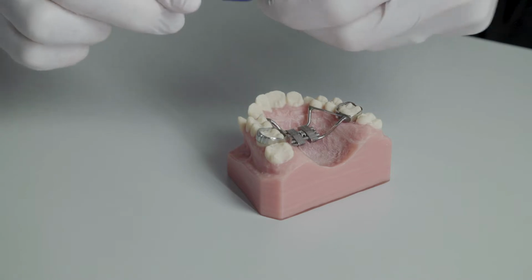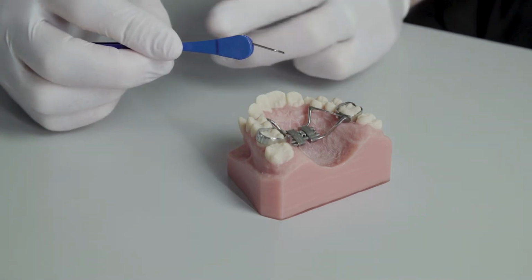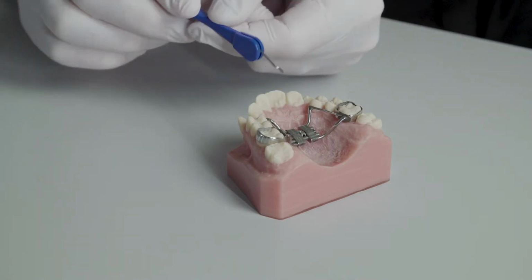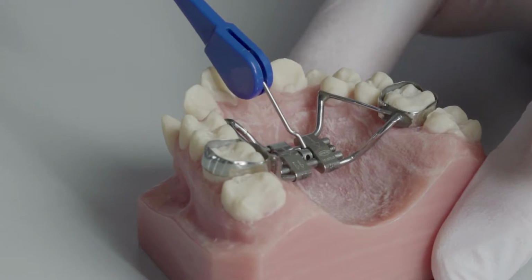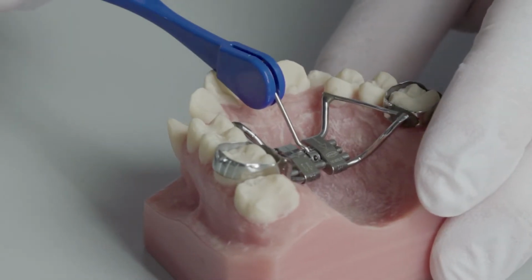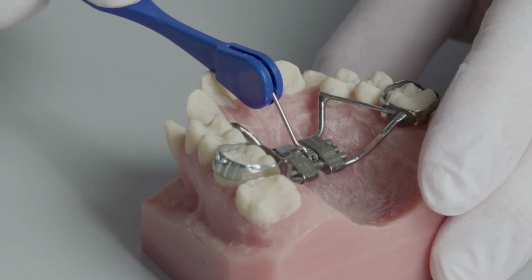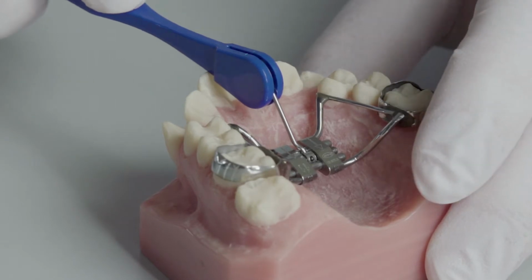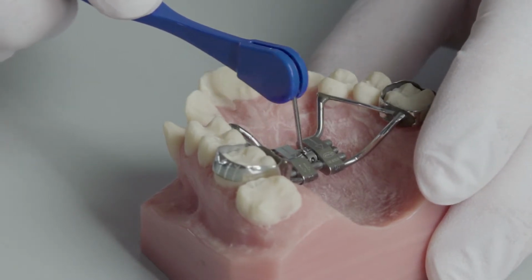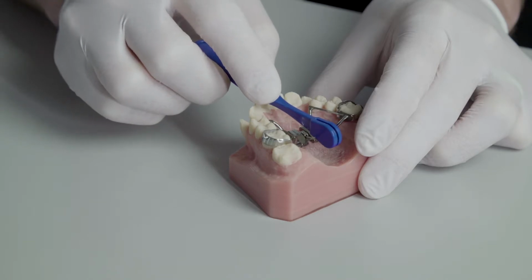Start by preparing your key. Have the metal portion at a small angle to the plastic handle. Insert the key with firm pressure into the hole of the expander, remembering that you can't place it too far because of the bend in the key. With firm but gentle pressure, push the key towards the back of the expander until you can't go any further. This will make the next hole visible for the turn the following night.